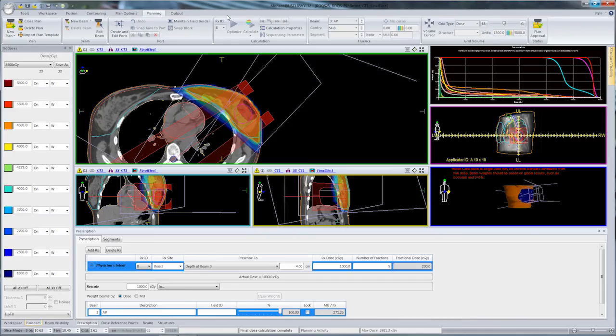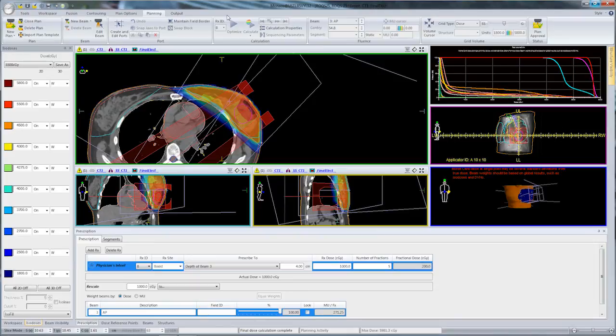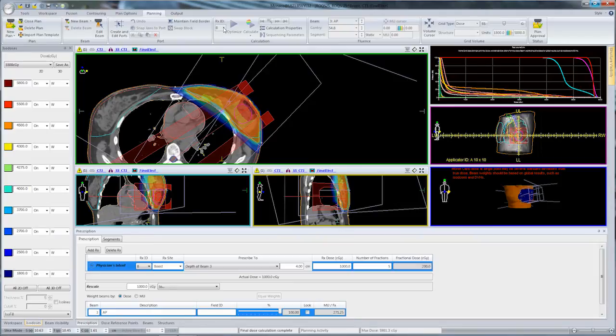With both prescriptions calculated and all beams and dose turned on, we can evaluate the plan. We need to make sure that RxB is not having any unforeseen impact on RxA when we look at overlapped hotspots.